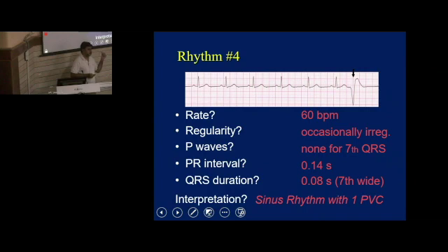So what is the difference between premature atrial contraction and premature ventricular contraction? In premature atrial contraction, there will be some recognizable QRS complex, preceded by an abnormal P wave. The P wave will be there but abnormal. In ventricular premature complexes, there will be a totally haphazard ventricular QRS complex, not a recognizable one. Right? So we have PACs and PVCs, premature atrial contractions and premature ventricular contractions. These are all occasional.